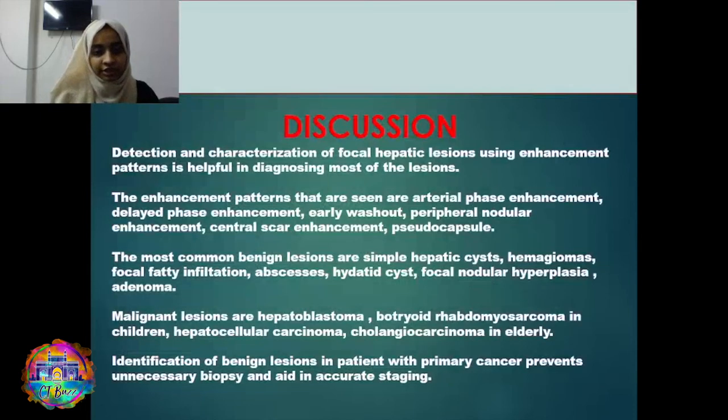Discussion. Detection and characterization of focal hepatic lesions using the enhancement patterns is helpful in diagnosing most of the lesions. The enhancement patterns that are seen are arterial phase enhancement, delayed phase enhancement, early washout, peripheral nodular enhancement, central scar enhancement, pseudocapsule. The most common benign lesions are simple hepatic cyst, hemangiomas, focal fatty infiltration, abscess, hydatid cyst, focal nodular hyperplasias and adenomas.